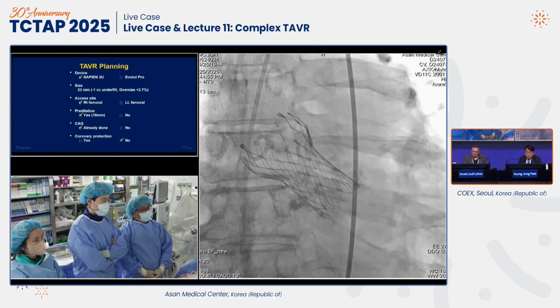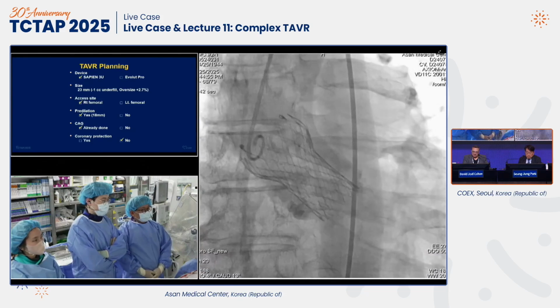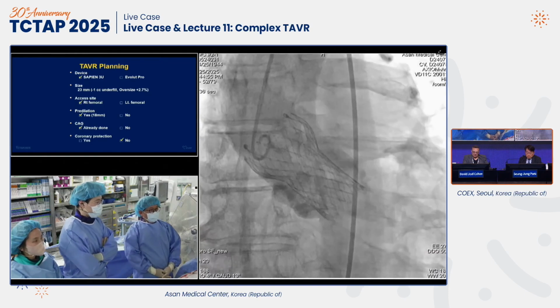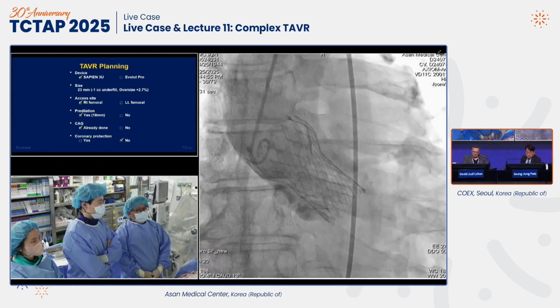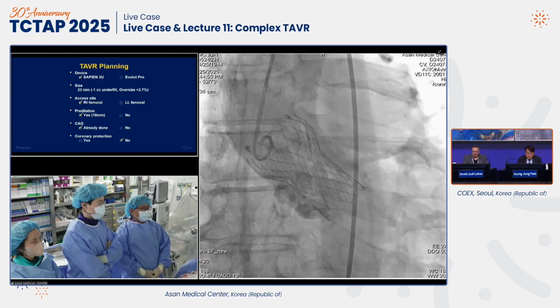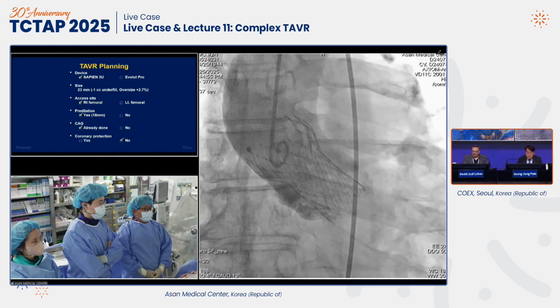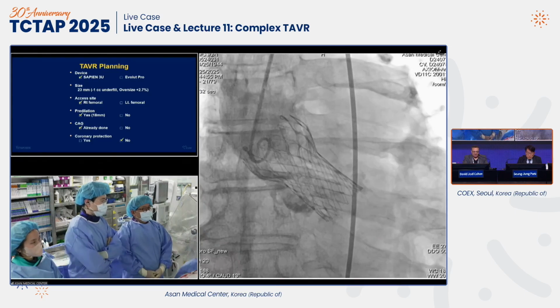We previously checked the coronary angiogram, but it failed to go through the strut. So the coronary catheter engaged outside of the valve. So you did not pass inside, you passed around the outside of the CoreValve to get to the left coronary. Yeah, right. Well, I guess you'll just go back the same way if you ever have to again. It's interesting.